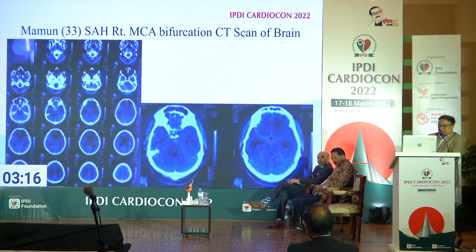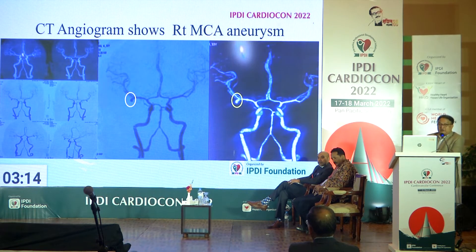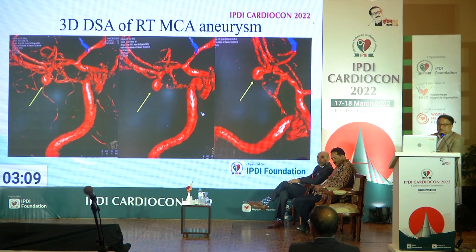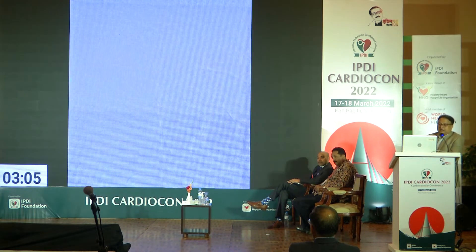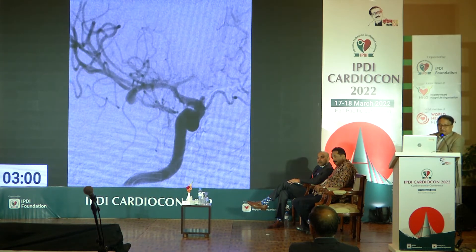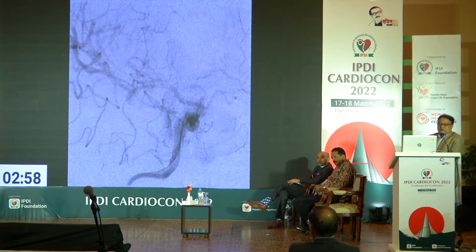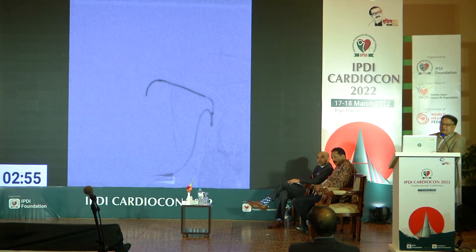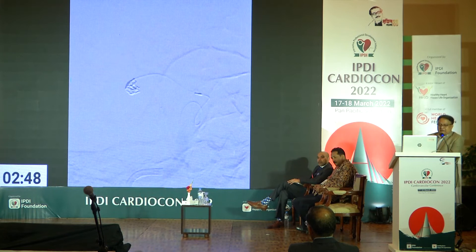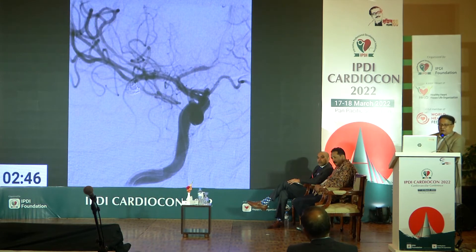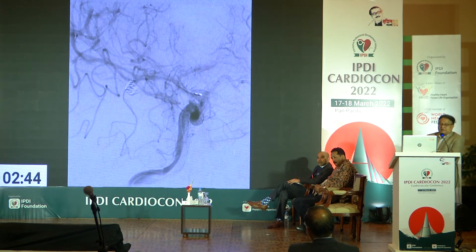In the second case — another typical subarachnoid hemorrhage — vascular imaging shows a middle cerebral artery bifurcation aneurysm. 3D DSA shows a grip-like aneurysm that had ruptured. We proceeded with the same approach: performing angiogram, detecting the aneurysm, and passing the wire. You can see how nicely we passed the fine wire. You have to be very careful passing the wire and maintaining the activated clotting time; otherwise, you may clot inside the brain and cause further stroke during this sophisticated work.